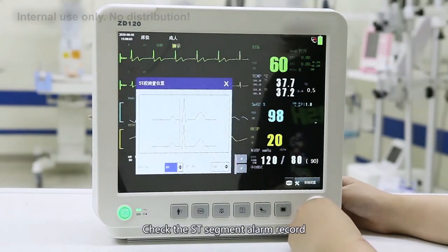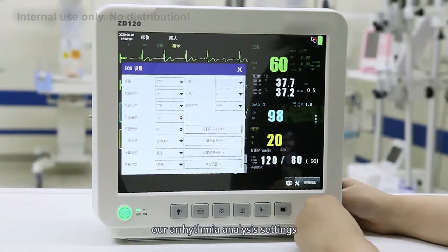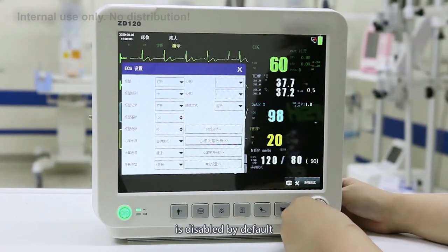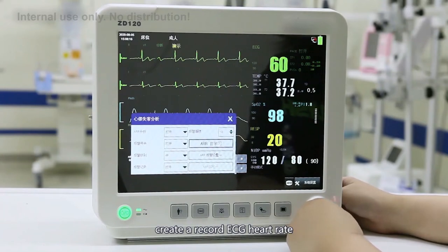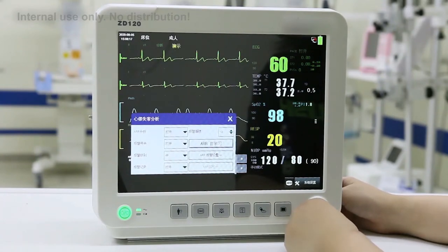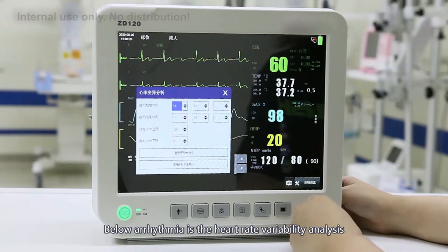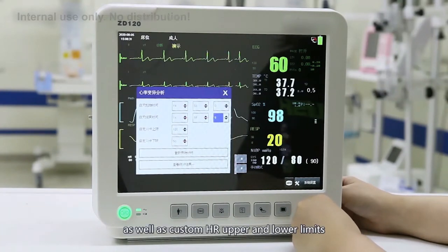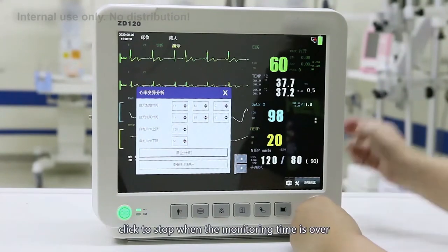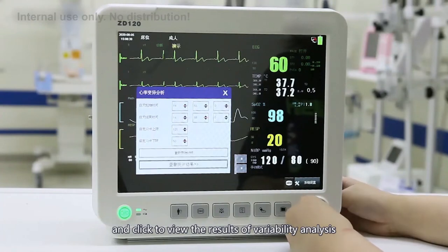Check the ST segment alarm record. Below the ST settings is the arrhythmia analysis setting, which is disabled by default. When opened, the system will automatically record ECG and learn arrhythmia patterns. Below that is heart rate variability analysis. Here you can select the start time and end time, as well as custom HR upper and lower limits. Click to start timing, click to stop when monitoring is complete, and click to view the results of the variability analysis.